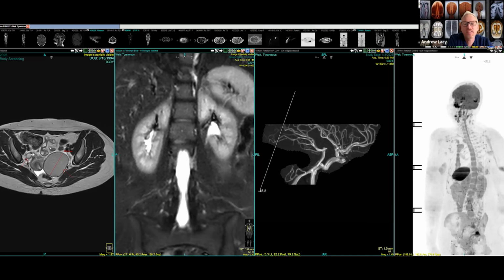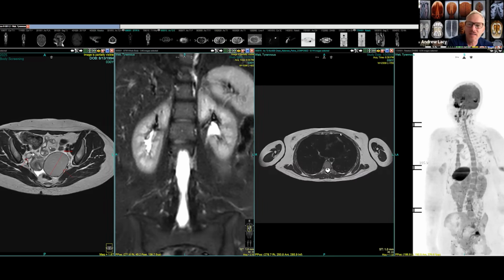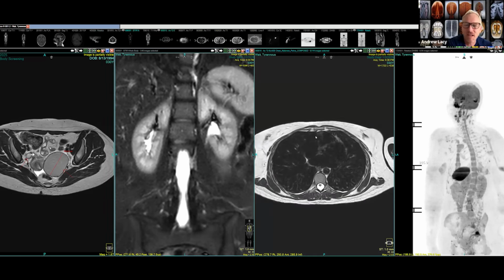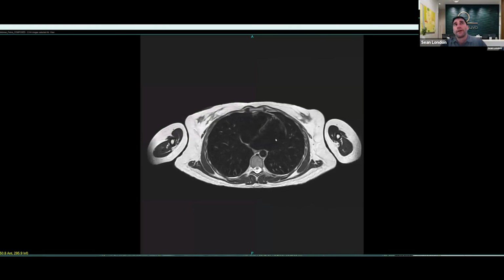Do we check for blockages in arteries? So I guess, obviously answer the question, but maybe talk a little bit about how we can get a sense of whether the heart is pumping well, and maybe get a sense of atherosclerotic disease. Yeah, so with MRI, there are techniques that we can do, but they're more dedicated techniques to look at that.